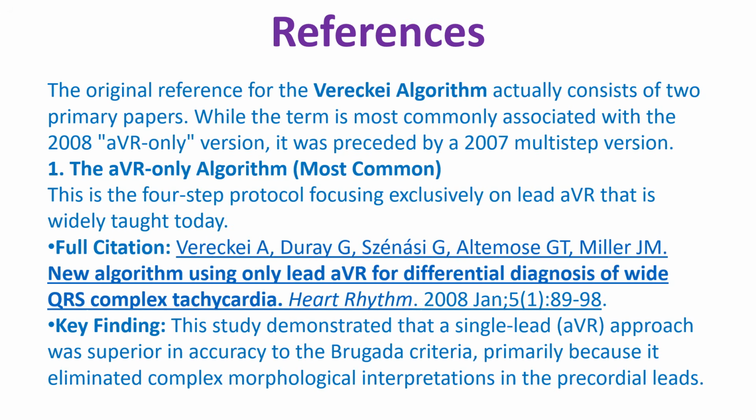The original reference for the Vereckei algorithm actually consists of two primary papers. While the term is most commonly associated with the 2008 AVR-only version, it was preceded by a 2007 multi-step version. The AVR-only algorithm most commonly used is the 4-step protocol we discussed, focusing exclusively on lead AVR, that is widely taught today. The reference is given here.